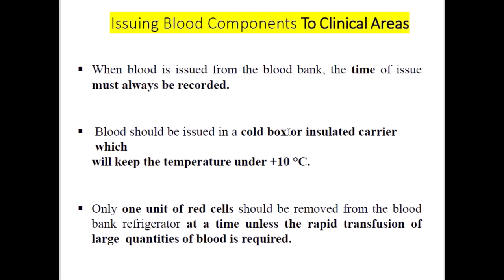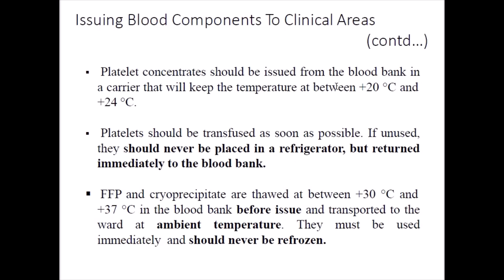Blood should be issued in a cold box or insulated carrier that keeps the temperature under 10 degrees. Only one unit of red cells should be removed from the blood bank refrigerator at a time, unless there is rapid transfusion of large quantities. Platelet concentrates must be issued in a carrier keeping them between 20 to 24 degrees, transfused as soon as possible, and if unused, never placed in a refrigerator — they must be returned immediately to the blood bank.